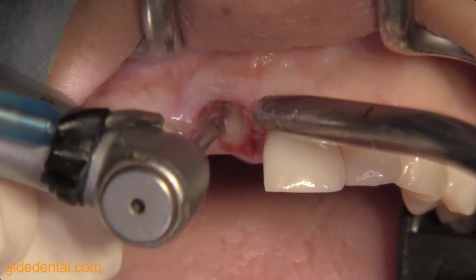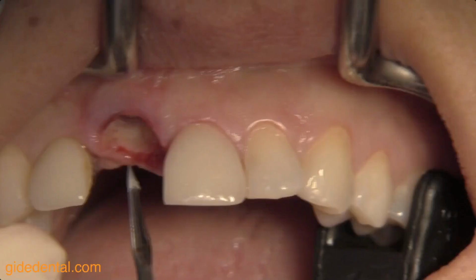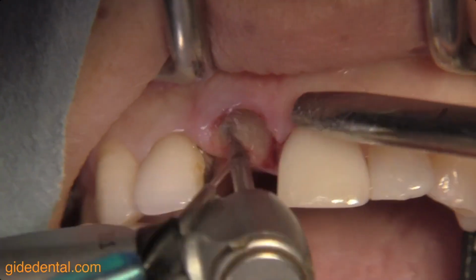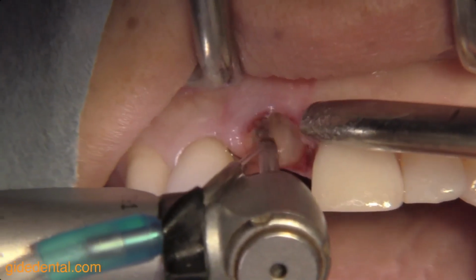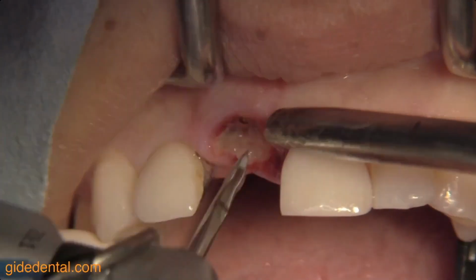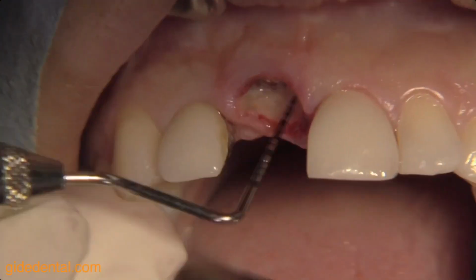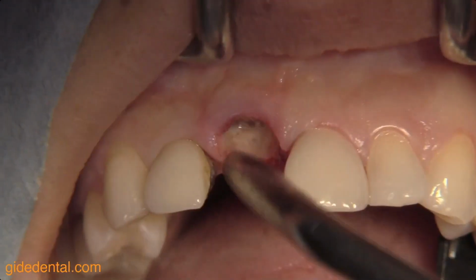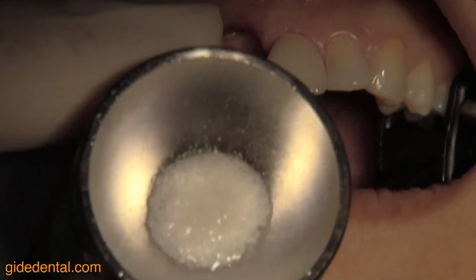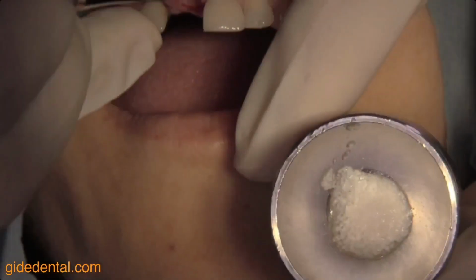Here I'm using a special little trick. I'm activating the bony walls with bleeding. So I'm using a precision drill, and I'm staying away from the implant, staying away from the adjacent roots, but I'm just perforating the cortical plate of the extraction socket to gain some extra vascular supply. So the blood flow, as you can see coming in here, needs to be activated, because all the healing is going to come from the blood. So that's kind of what we're doing here. We're increasing the angiogenesis in this area.